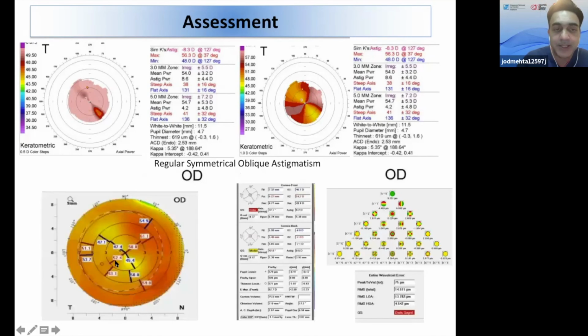If you look at the Pentacam, it allows you to do a little bit more quantification. In fact, when you look at the Pentacam in a bit more detail, what you can see is there's almost a 5.5 diopter difference in the treatment across the hemimeridian on this side, and across the total side over here, there's almost 8 to 9 diopters difference in treatment as well.